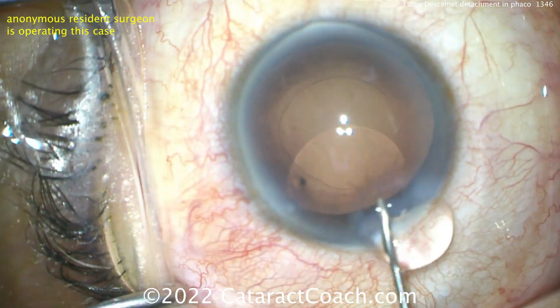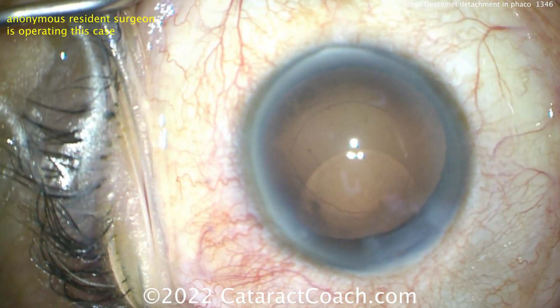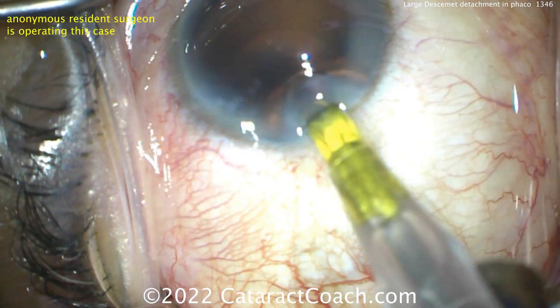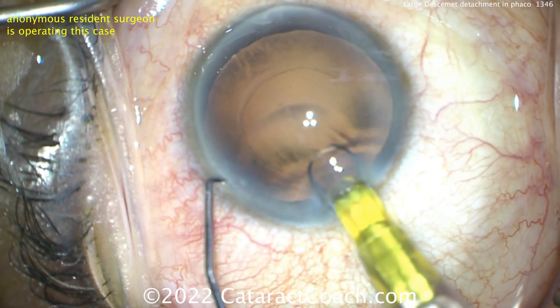Now we're waiting while the lens is being loaded. Watch — here comes the lens. It's misloaded. You can always tell because look at the plunger — the plunger's not behind the lens, it's kind of halfway in the middle of it. Delivering the lens, it's really tight.